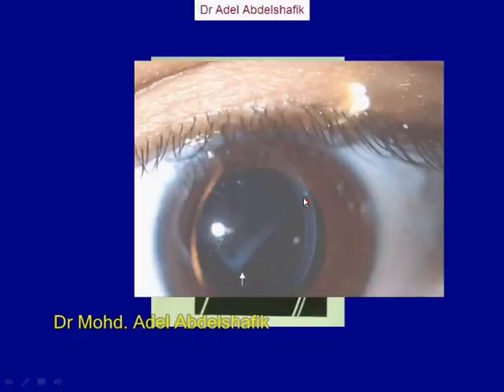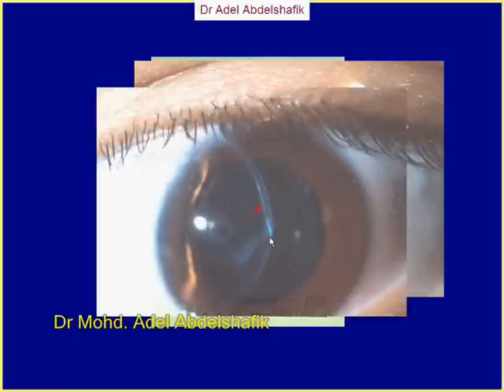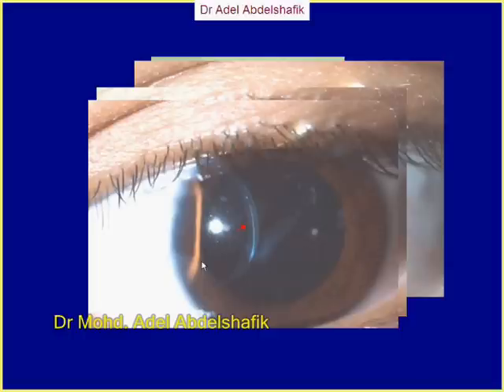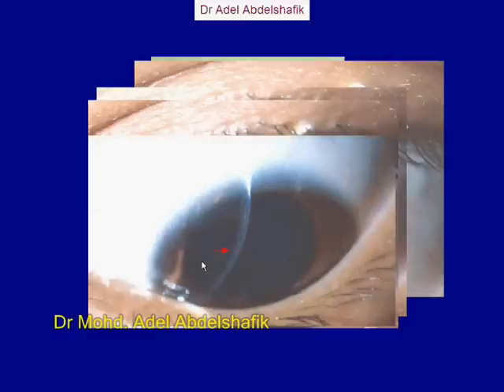Notice this part. What do you see here? There is a line in the stroma. What is the level of this line? Maybe say 1/3 to 2/3. It's superficial 1/3. Now we start to make section in different parts. Here, this is another to the nasal side, another section, and you notice the line, and this is another section and another location.